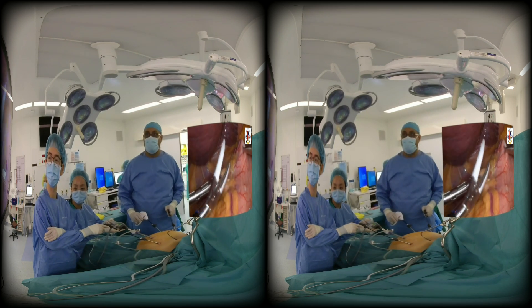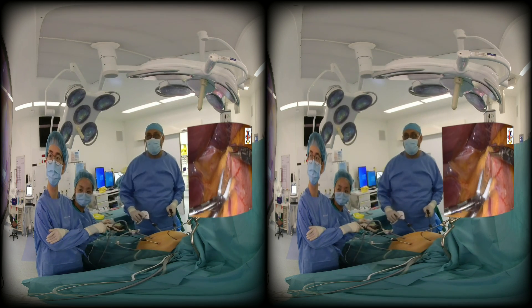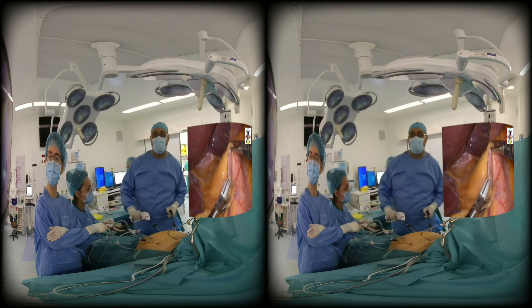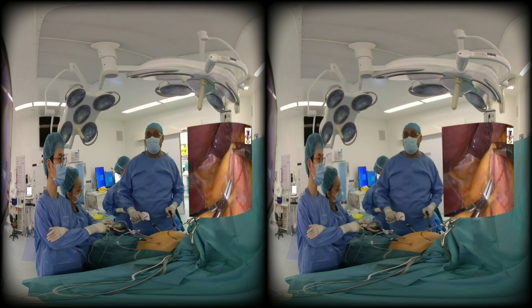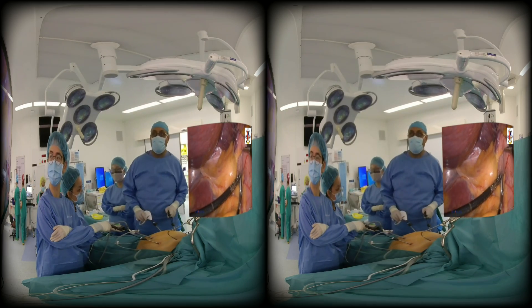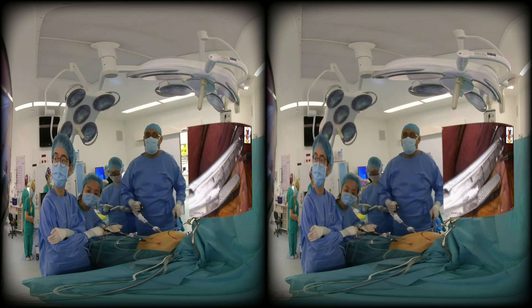As you go along the lesser curve, you will meet vessels — both anterior and posterior. As you meet the vessels, you may wish to burn them. Why do we preserve the vasculatures and the nerves on the lesser curve side? It is to basically preserve the continuity of the vessels and the nerve. Here you can see that we are in the lesser sac.